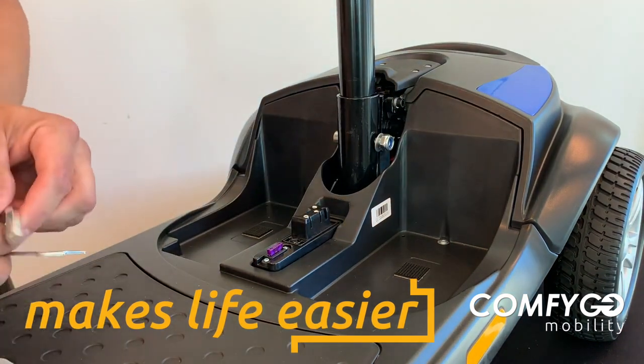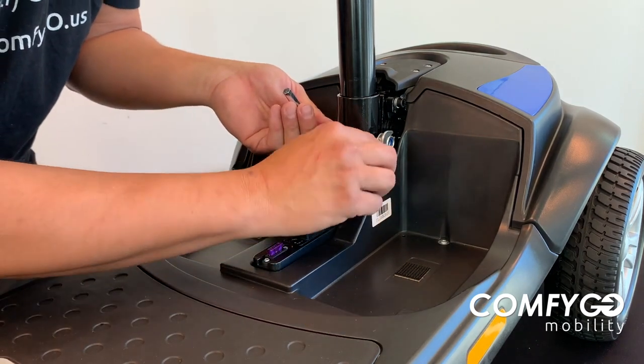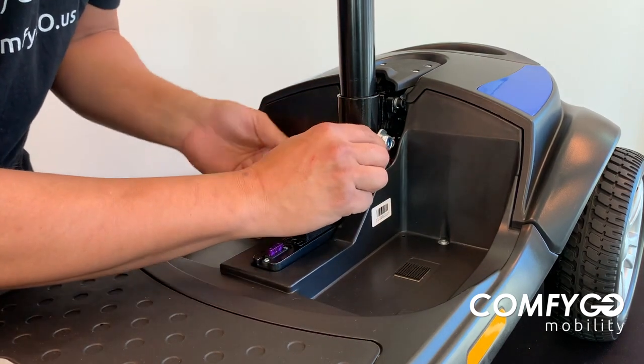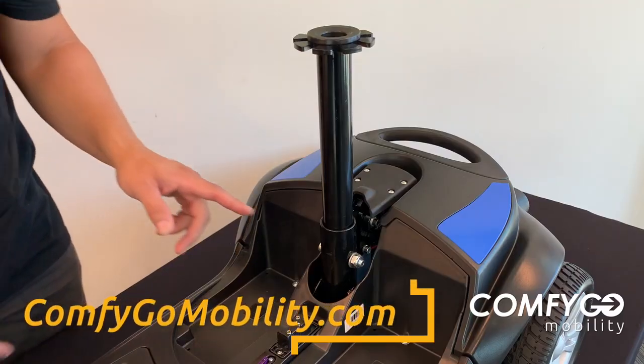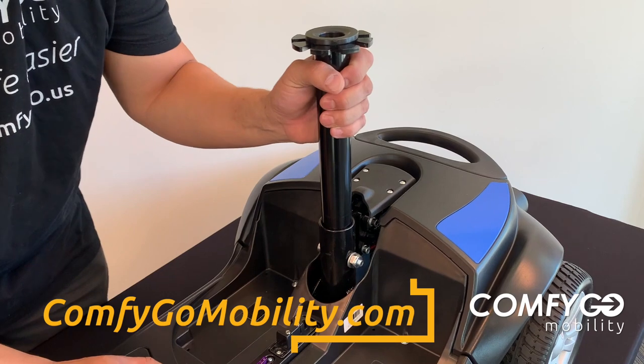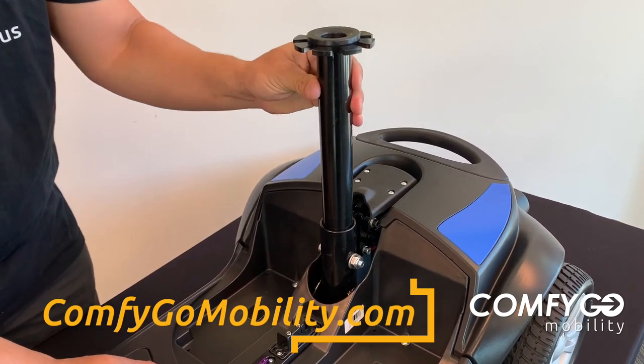Then let's get the supplied tools that come with your Z4 scooter and tighten these up. You want to make sure this is nice and tight. You can see that it moves the whole mobility scooter when I do this, so it's very tight.